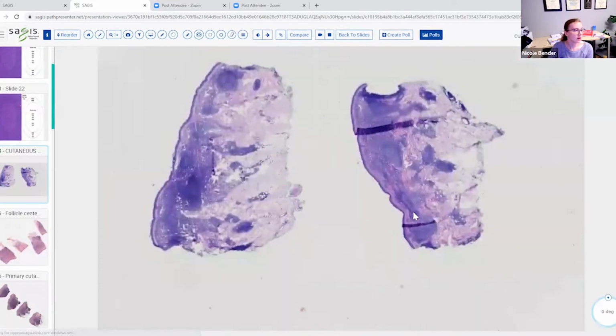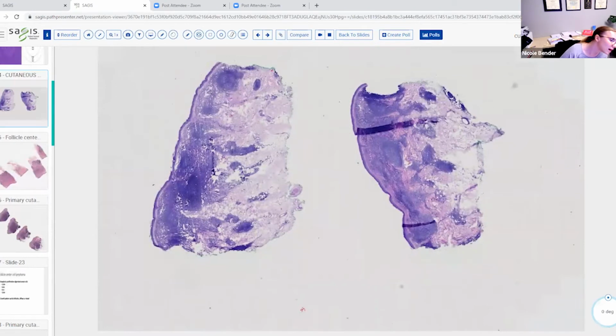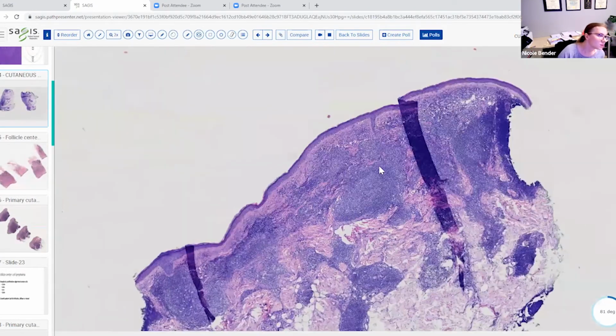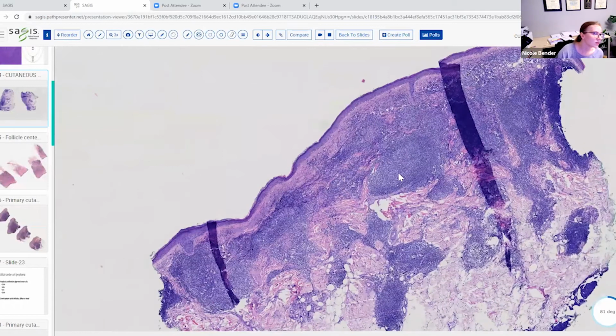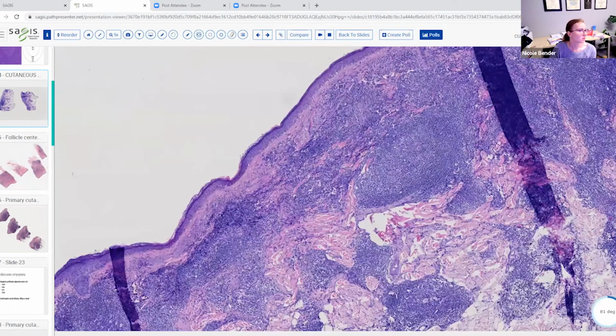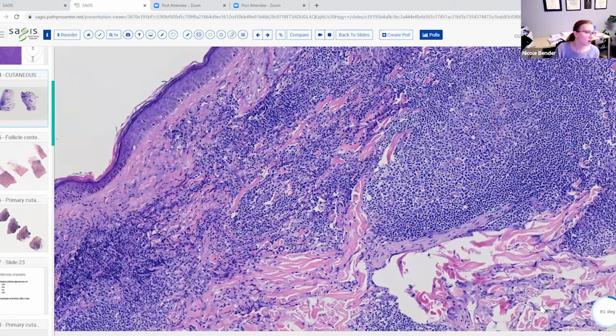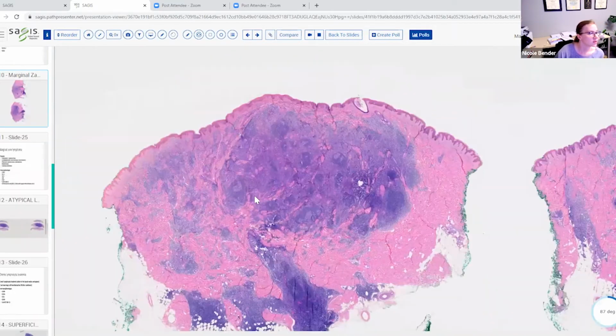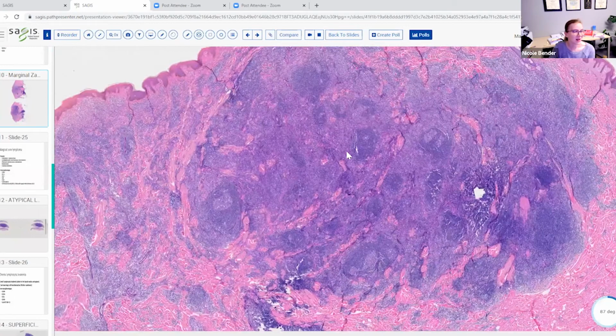You want to just take a peek at that really fast again. The cells between were not pale. The cells between follicles were more hyperchromatic. They look like normal small lymphocytes, mature lymphocytes, nothing special. This one instead, the cells between are pale staining in comparison.